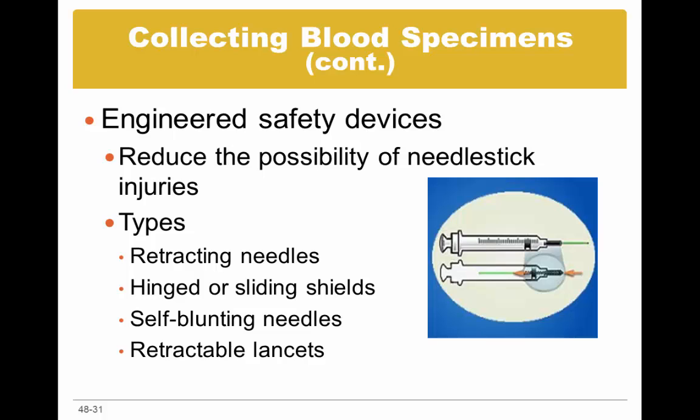Okay? The reason for this is to reduce the possibility of needle stick injuries. You might see retracting needles, hinged or sliding shields, self-blunting needles, and retractable lancets.